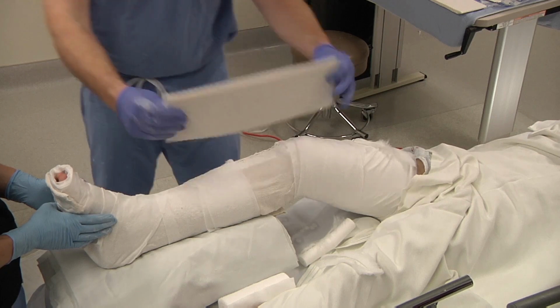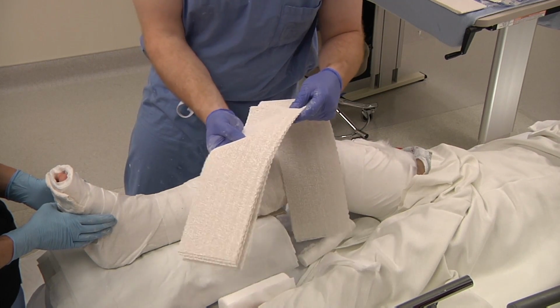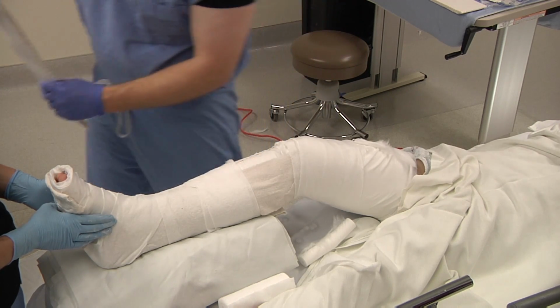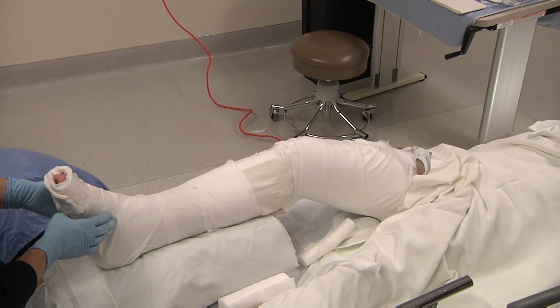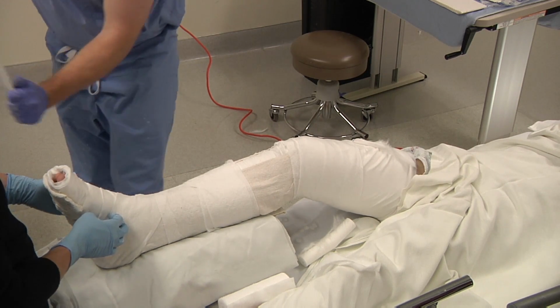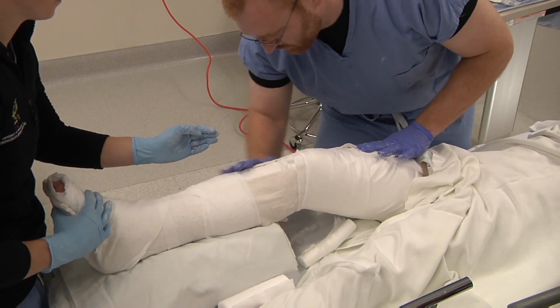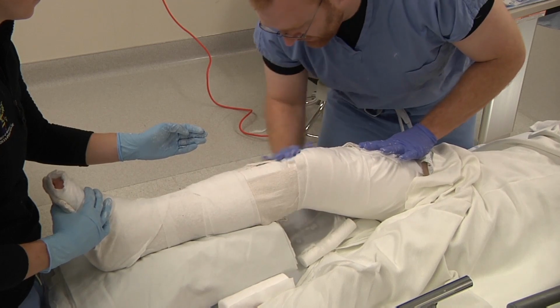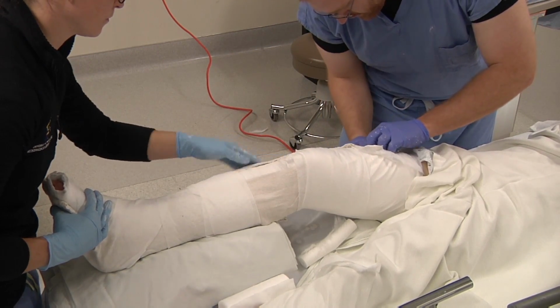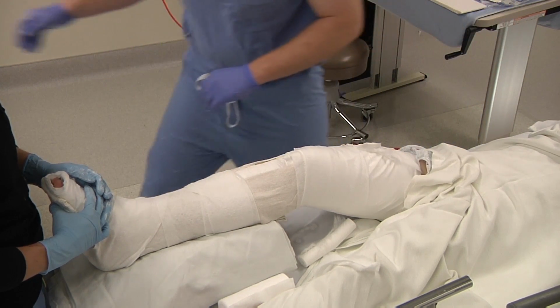Next, we're going to take our, this is 5 ply, 5 by 30 inch. We fold it in half. Dip it, keep it pretty moist, make sure to laminate it. Now we're going to do these extensions up the leg. Really got to pay attention to laminating this portion into the lower leg segment. You need to turn down the top so that it's not extending above your plaster.